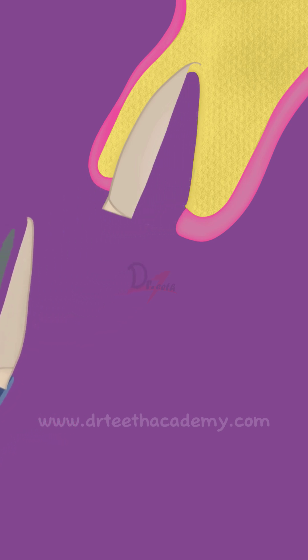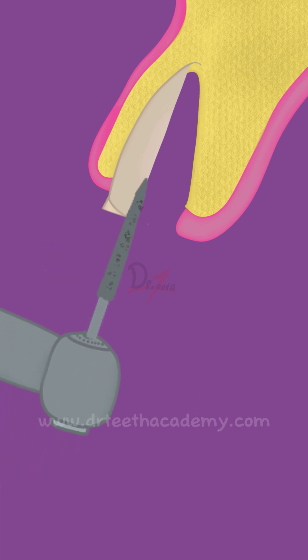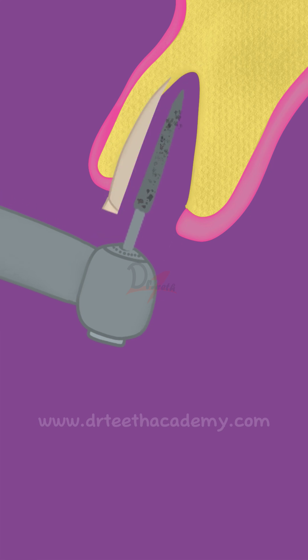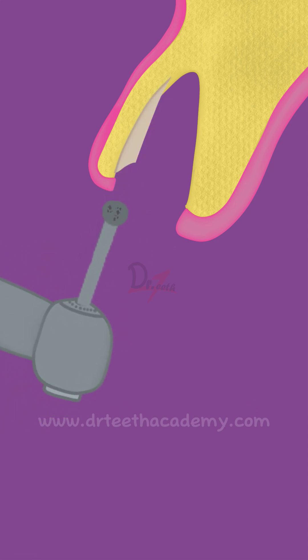Now after this, we are going to shape the buccal portion. We create a shield of about 1.5 to 2 mm wide, trim it to the bone level, and give an S-shaped bevel.